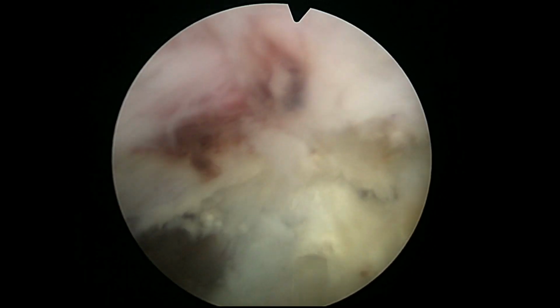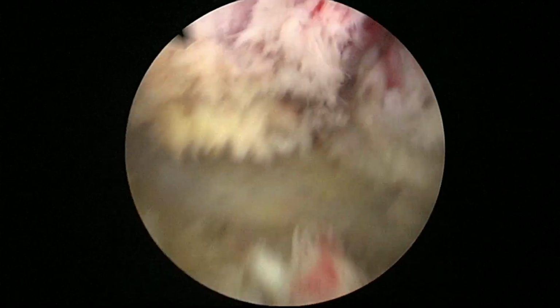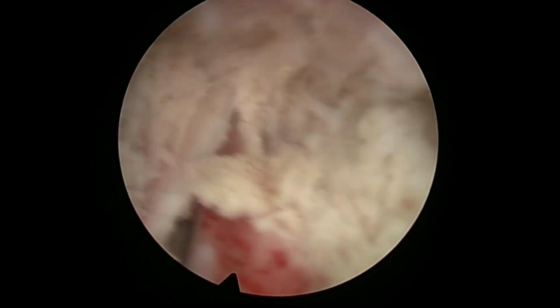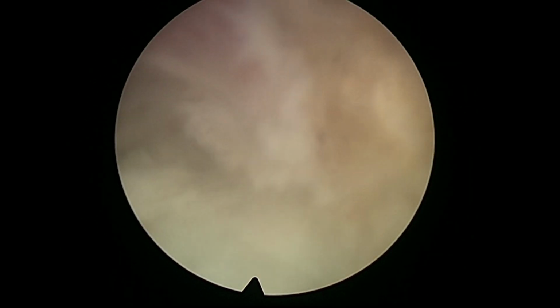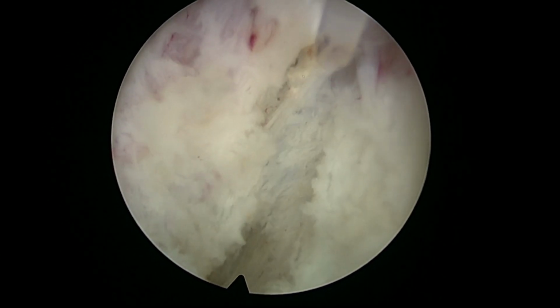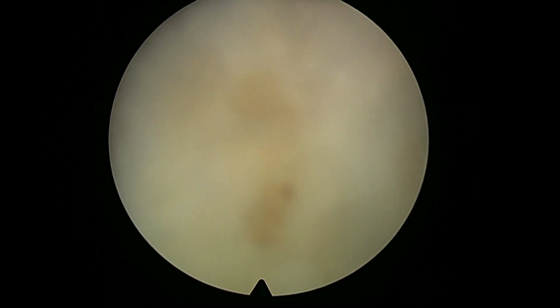Also, I think there is another potential factor that is interesting to take into account. If the tissue is very hard, sometimes very, very hard, often the morcellator will not be able to chew it. Then if you release the adenoma completely, you will have a lot of trouble morcellating the adenoma, and you will end up going in with a resectoscope, trying to cut a loose piece in the bladder, which is quite challenging and difficult and sometimes risky. So you have to judge the quality of the tissue, because if you try morcellation, you better be lucky.